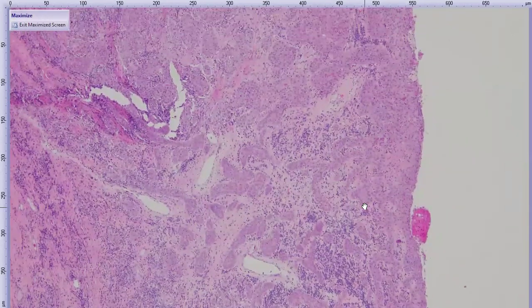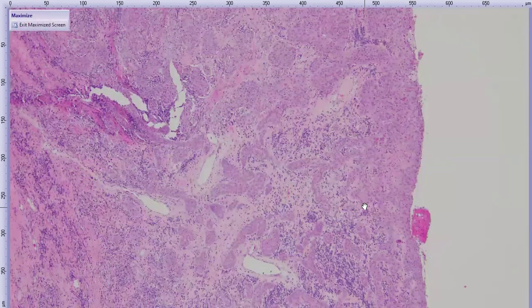And the interesting thing about this squamous cell carcinoma in this horse in particular is that it is mostly in the stroma the way it is and not forming much of an exophytic mass. And so this is a type of squamous cell carcinoma in the cornea of horses that we refer to as a corneal stromal invasive squamous cell carcinoma. Basically just calling it like it is. It's mostly an invading the stroma kind of tumor.